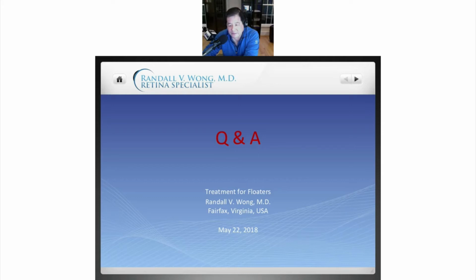Sarah says, do I need to perform a wash vitrectomy for debris left over in patients to remove Kenalog? No, I don't. Kenalog gets absorbed rather quickly. We would just do a vitrectomy and that would clean everything out, I think. Josh says, some doctors that do FOV now are doing so with air bubbles versus gas. Do you see a benefit to this rather than having nothing?